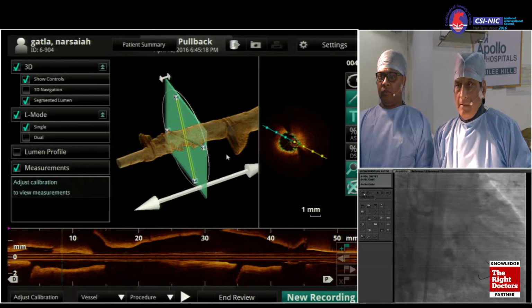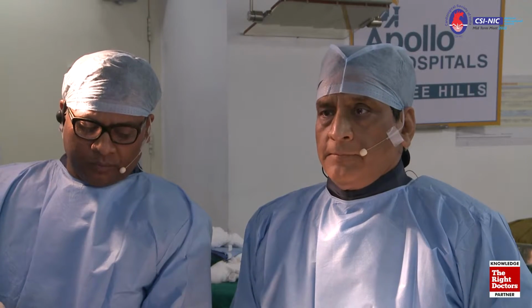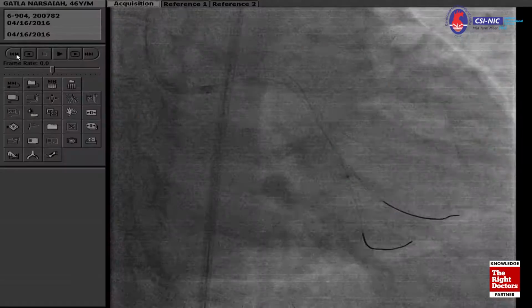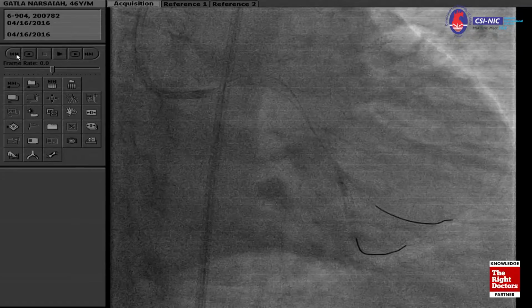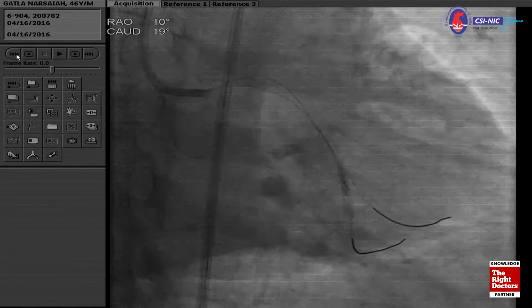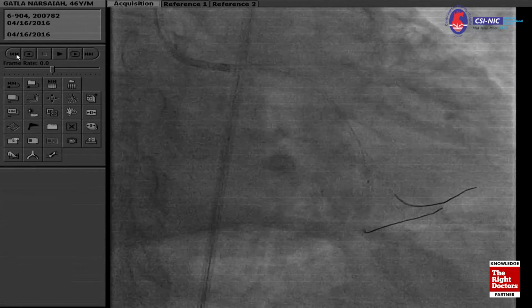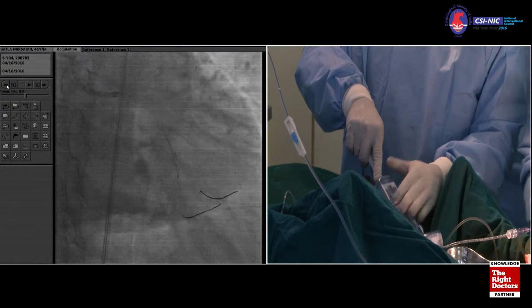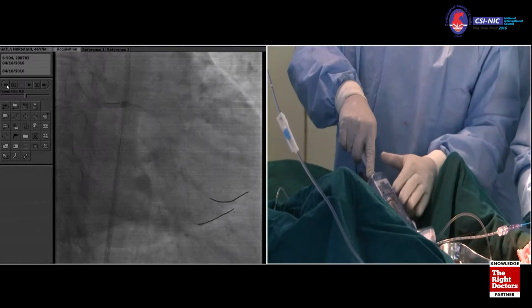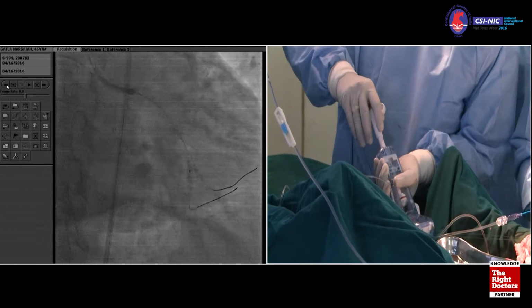Yeah, if you close. Good. Yeah. Go up. Open this first. Yeah. So once you do it, then we have our 2.5 balloons ready. 8, 10, 10, 12, 14. 12, 14. Negative. Good. I just want to make sure that everything is smooth. Good. You want to do it once again? Go. Going. 2, 4, 6, 8, 10, 12.